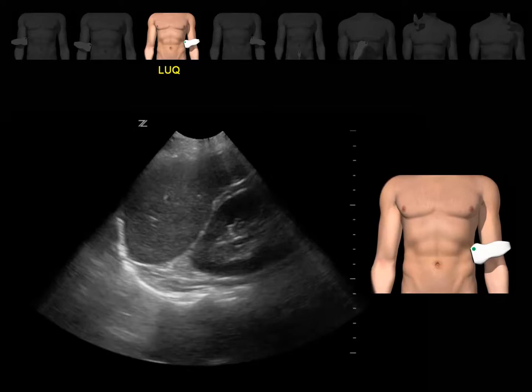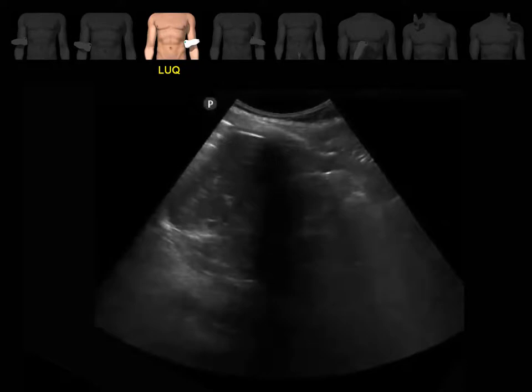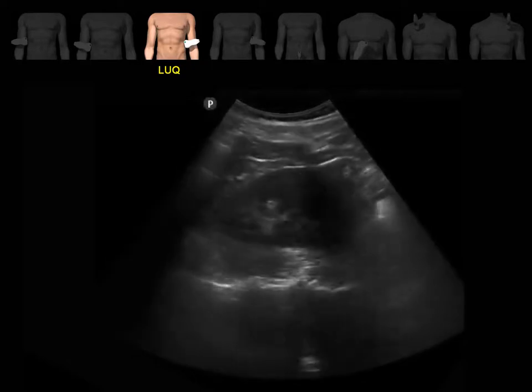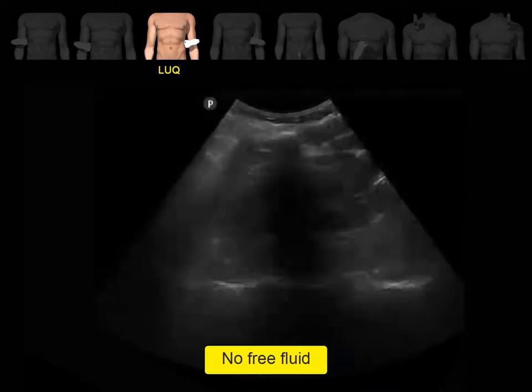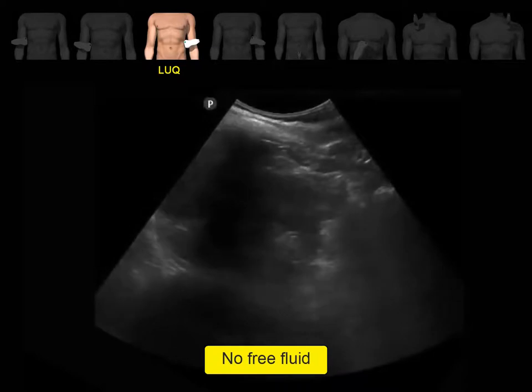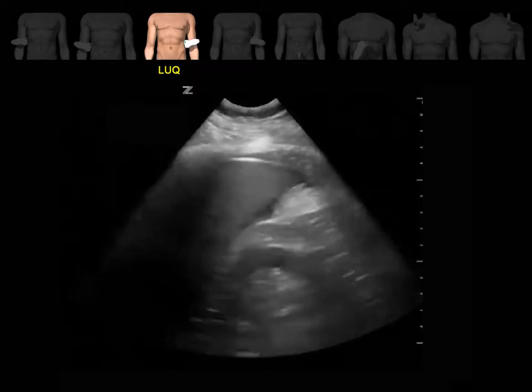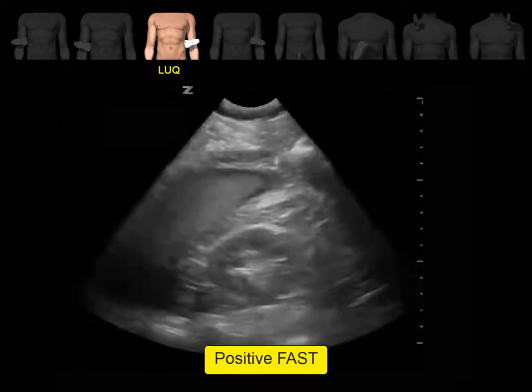This is the image that you should see — here is the spleen, the diaphragm, the left kidney, and the spines, which appear as a hyperechoic structure further from the probe. In this clip, we can see the spleen, the left kidney, and the diaphragm, with no black stripe around the spleen or between the spleen and the left kidney — this exam is negative. This clip shows free fluid around the spleen and between the spleen and the left kidney — a positive FAST exam in the left upper quadrant.